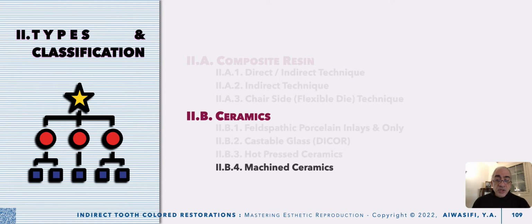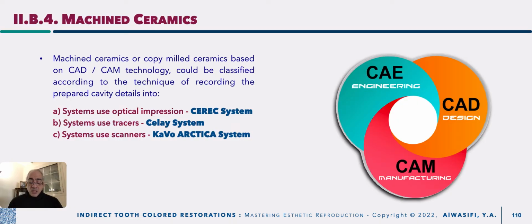Machined ceramics in general mainly depends on how to copy mill the restoration from a model. This model could be generated either by an Pro Inlay or wax pattern or generated by a digital system.